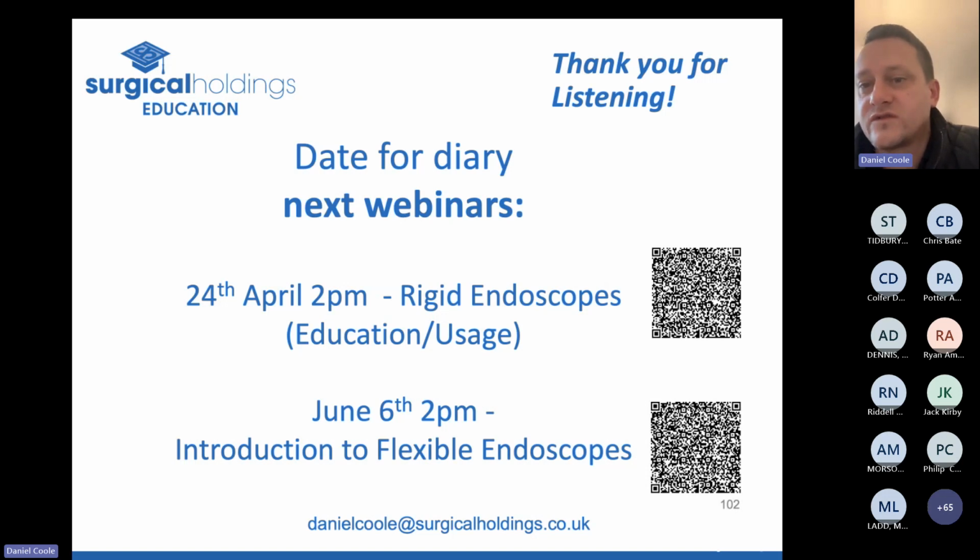We could, if it was something somebody wanted, of course do due diligence on the steel, and we could send them away to a lab and have them tested. But in my opinion, if we put the instruments through our passivation process, you very quickly see if they're not to the correct specification. Quite often, if you put steel that's not got the correct amount of chromium in, the device will go black, it will discolor. So this is a good way to test this.